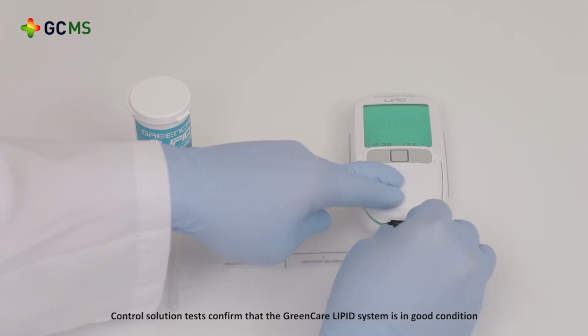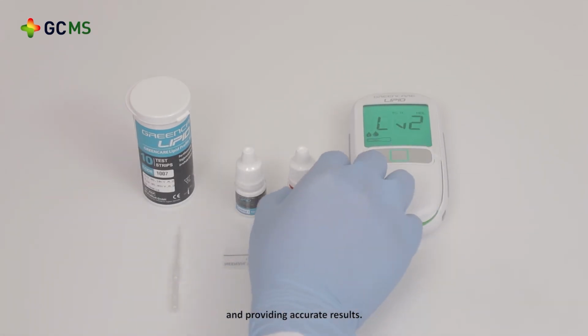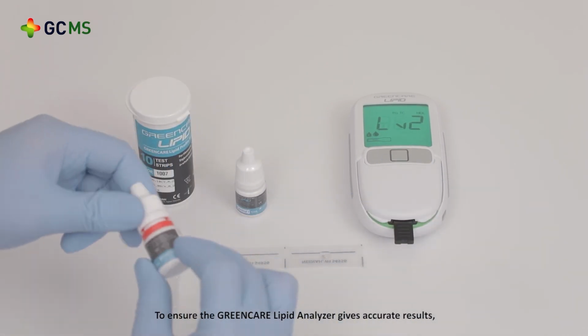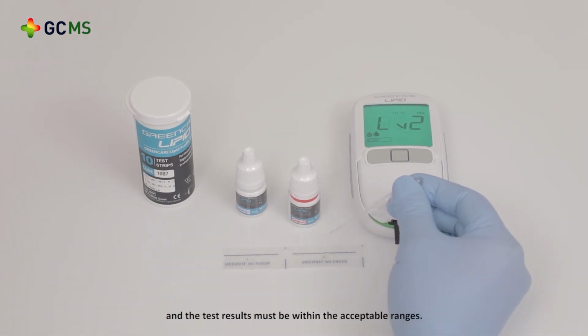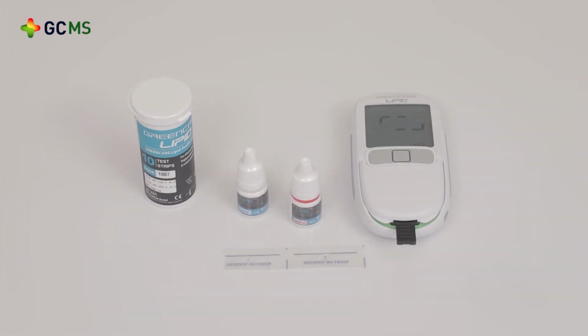Control solution tests confirm that the GreenCare Lipid system is in good condition and providing accurate results. To ensure the GreenCare Lipid Analyzer gives accurate results, control solution tests must be carried out periodically and the test results must be within the acceptable ranges. Kindly refer to the user manual to learn the recommended frequency of control solution tests. To purchase the control solution, please contact your local distributor.